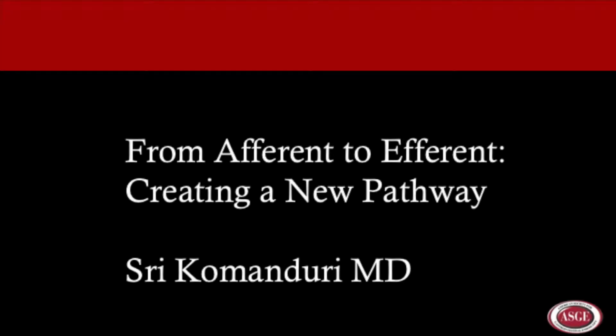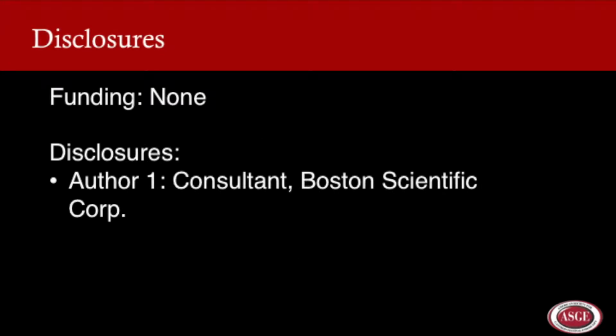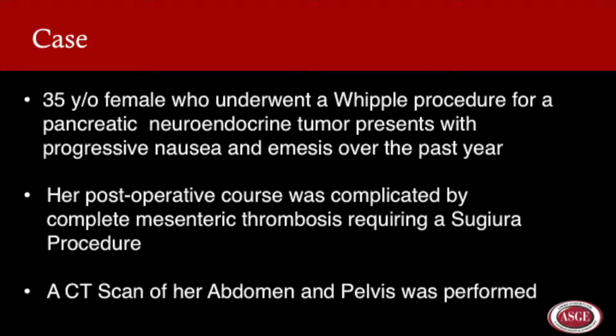From afferent to efferent, creating a new pathway. This case is of a 35-year-old female who underwent a Whipple procedure for a pancreatic neuroendocrine tumor who presents now with progressive nausea and emesis over the past year.